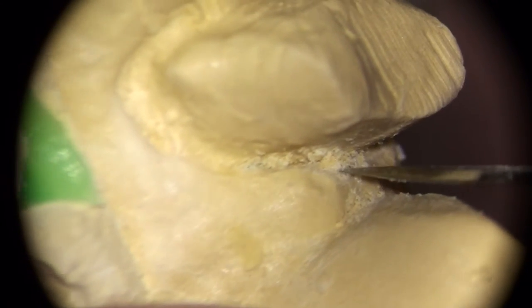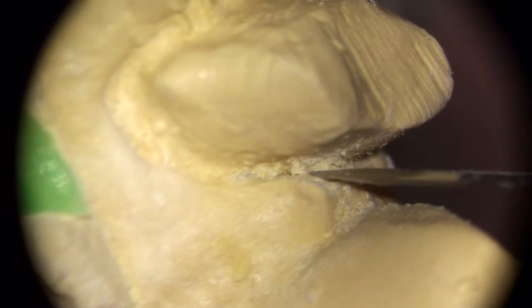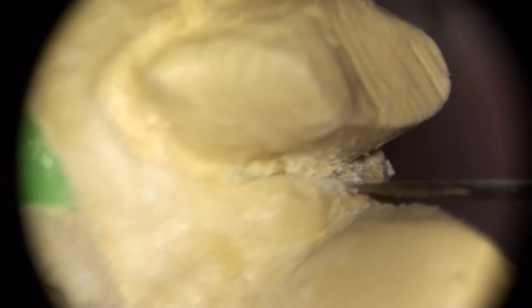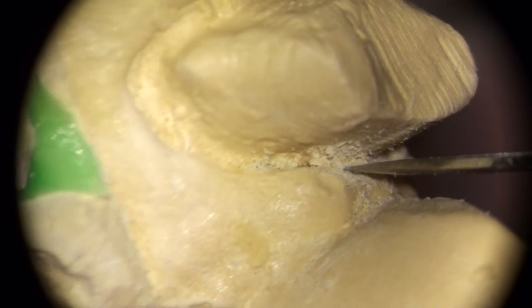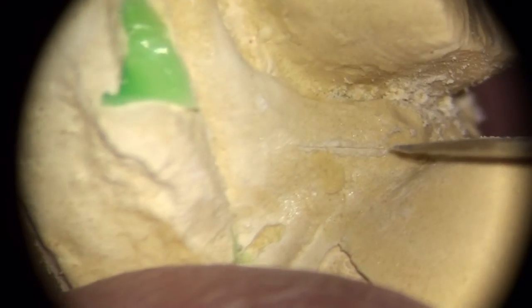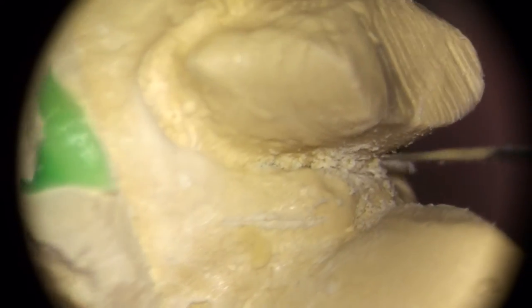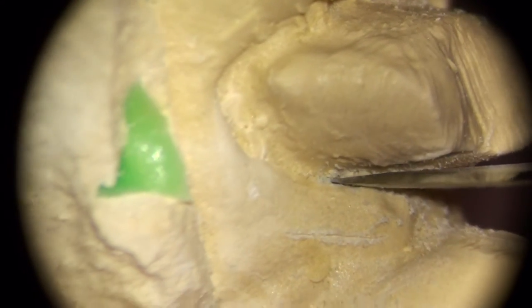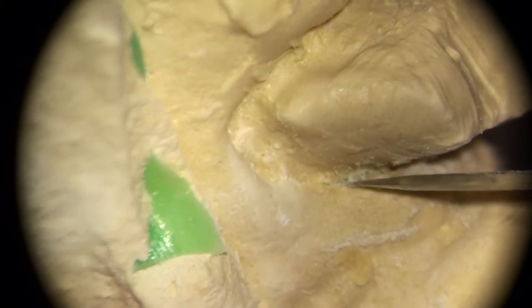You see, you can define a very tiny little edge with this 12B blade. And because it's quite stiff, as I mentioned before, I used to use an Explorer just to kind of define those. I would just come in and just define a line, say that's where my margin's going to be. But the Explorer would flex a lot when I did that, made it really tricky to get a nice smooth edge. So you just kind of follow. Can't really tell where that margin is.